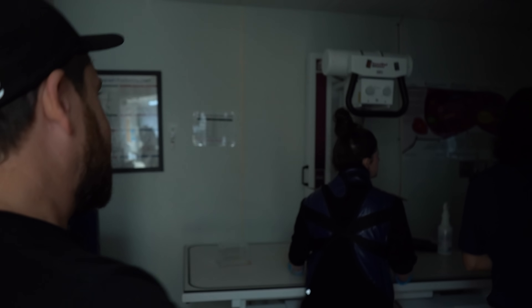It's not as pretty, but you can see the microchip there — that's neat. But no shelled eggs at this point. We'll go through them all and look for eggs.